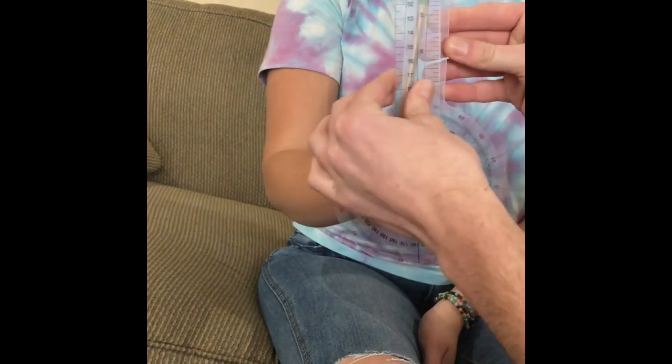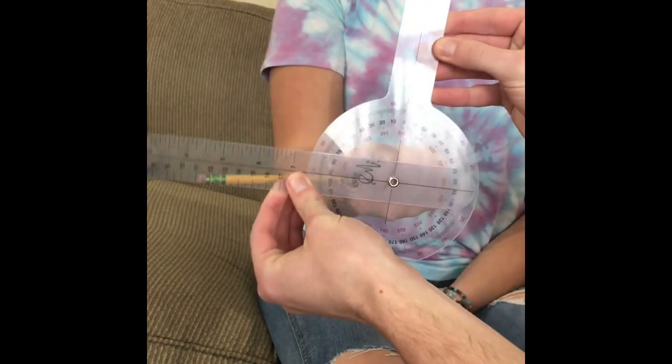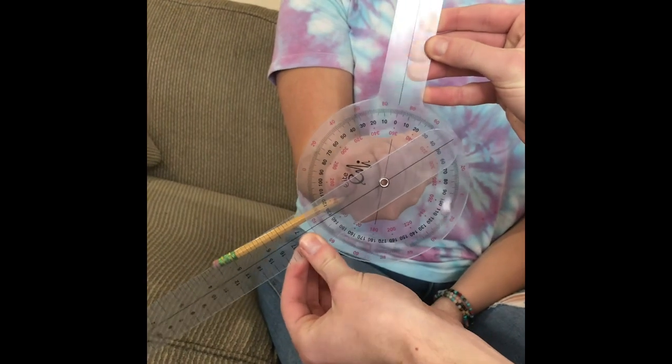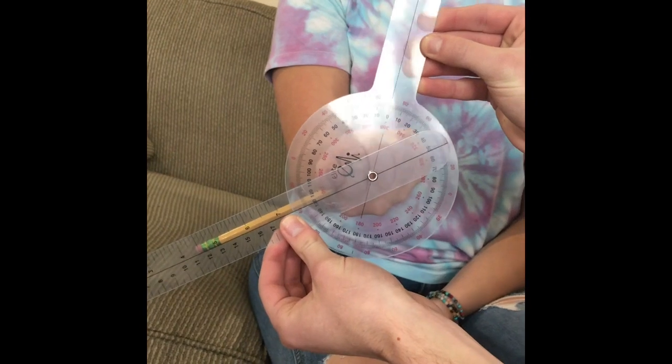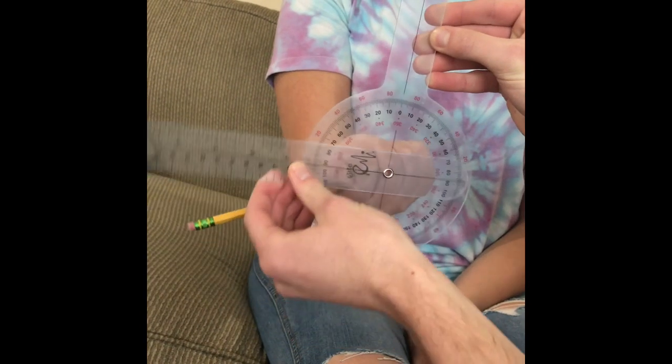And then we're going to move it over to the left. This would be supination right there at about 130 degrees of rotation. And back to center.